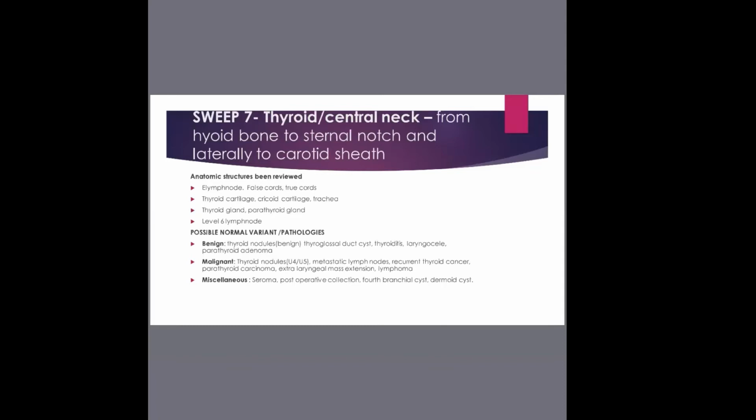It's also very important to just look through and see the joint itself. If there's degeneration, you see a cortical irregularity, and you put your flow there. If there's no flow, that is classical for degeneration. But if there's flow, you might be looking at synovitis. So those are also things to consider when doing head and neck ultrasound.